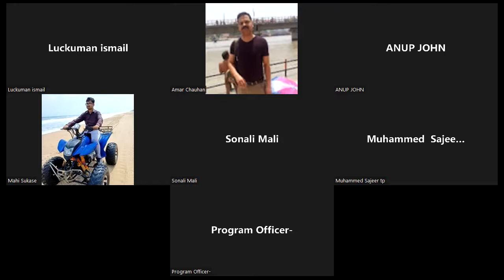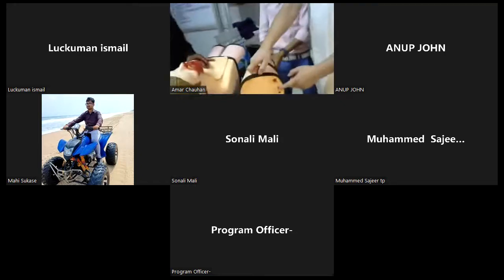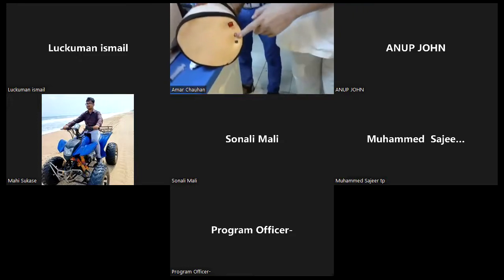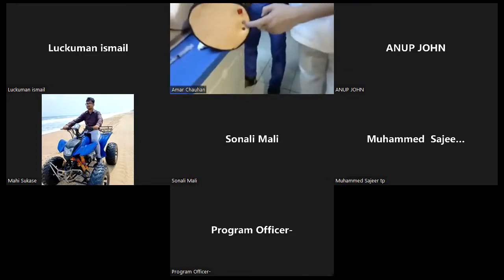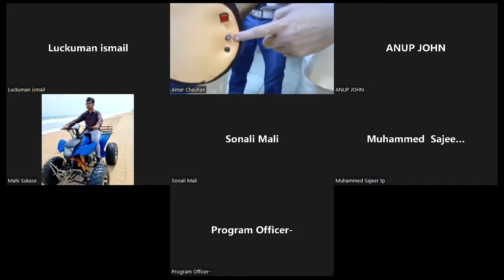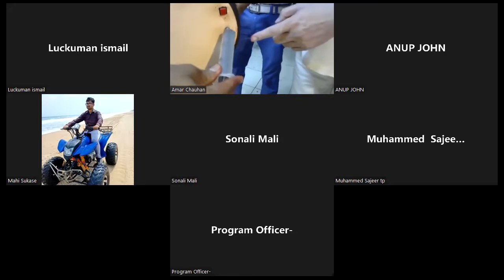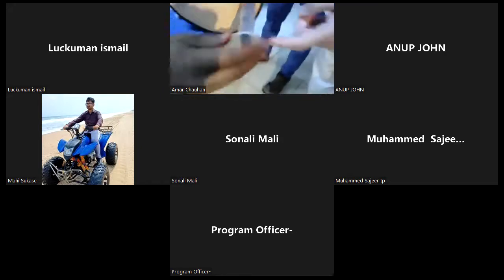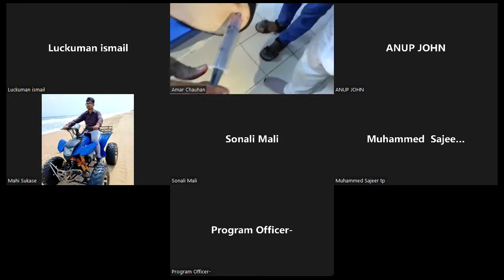So this is the port, and you can read it through this port. You can fill blood in this mannequin. Can you see, Lukman? Yes, sir. So this is the port you can fill this mannequin through. You can push blood inside.